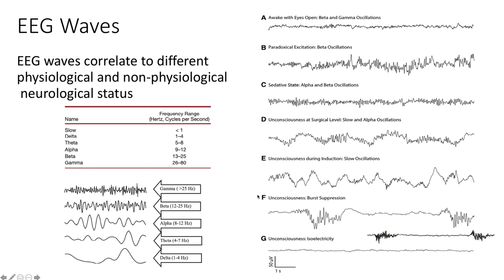And this proceeds into more of a coma status, a pattern you may have heard of before, burst suppression. So you have an area of almost no electrical activity, just a little bit of field potential, and then areas where it looks like a burst. So that's why it's burst suppression. It can look like this, or when it's a higher frequency burst suppression, something more like that. And if you induce a coma, you count the amount of burst suppressions you see per window or per defined time frame.